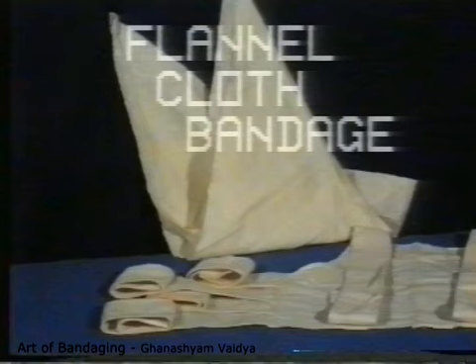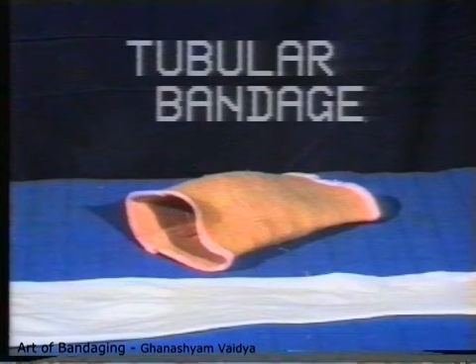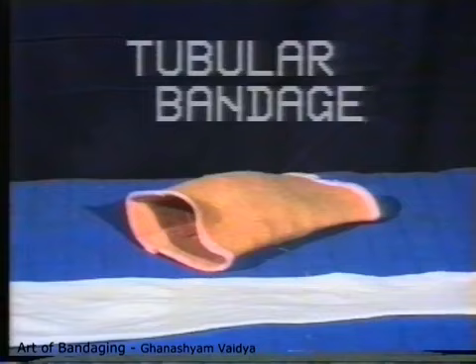Calico, muslin or flannel cloths are used to prepare triangular slings and many-tailed bandages for chest and abdomen. Tubular cotton bandages of various sizes are available for fixation of dressings over the limbs, fingers, scalp or trunk. The kneecap seen here is an elastic tubular bandage.